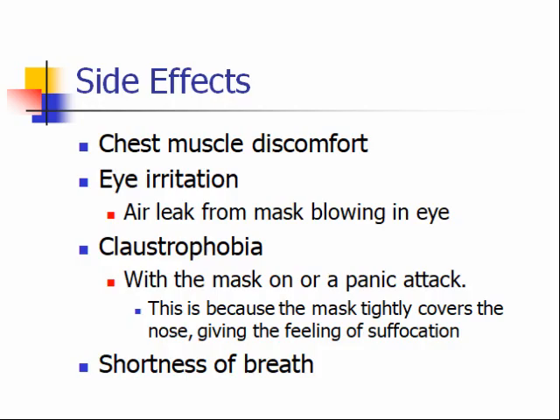Claustrophobia. Some patients don't like the fact that they have a mask on. It can even get to be a panic attack. This often occurs when you use a full face mask that covers the nose and mouth.